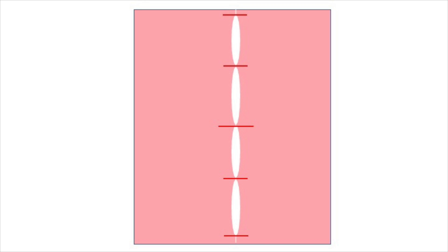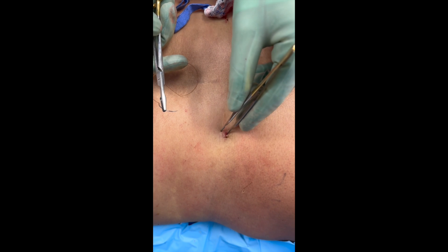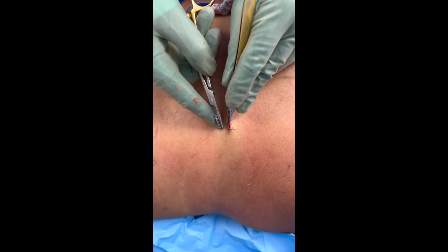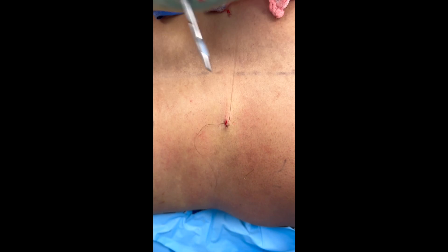You can repeat this technique over and over until the incision is closed. As you get more comfortable with this technique, in order to improve efficiency, you don't need to necessarily reposition the needle in the needle driver in between the sides of the skin. You can simply pass the needle through both sides of the skin, grab it in your forceps and pull it through. As long as you follow the curve of the needle, this technique works just fine.